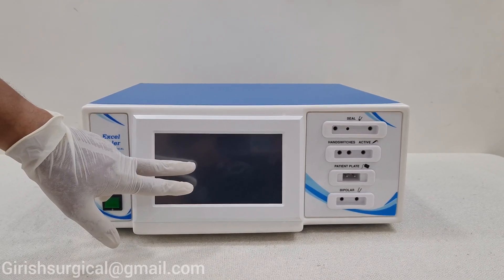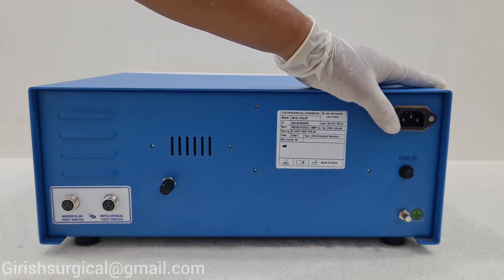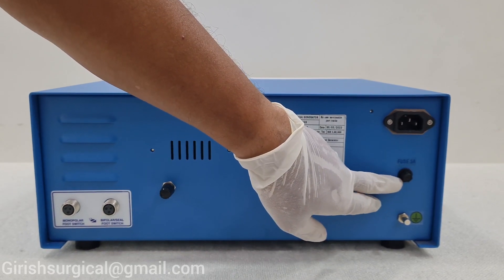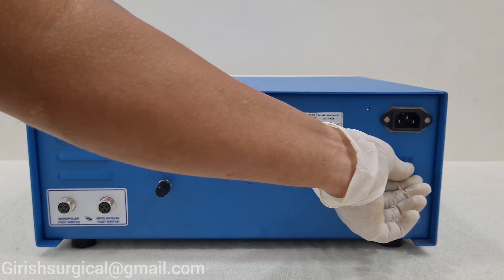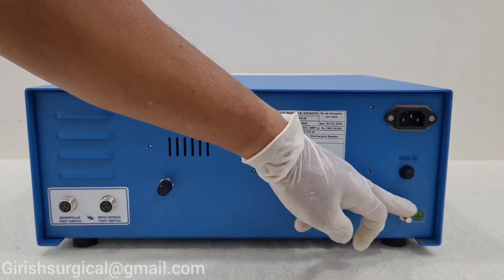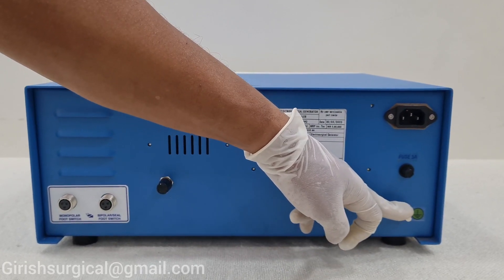In this there is a touch screen. At the machine backend there is a port where you can insert the mains cord. Below that you can see a fuse — if the machine has been fused, you can get the fuse here and replace it. Here is the earthing point; if there is no earthing in the OT, you can give the earthing point here.